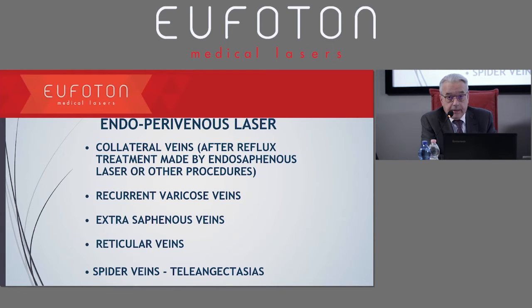So the indication of this Endo-Perivenous treatment: collateral veins, at the time of the surgery or at a later stage, recurrent varicose veins.